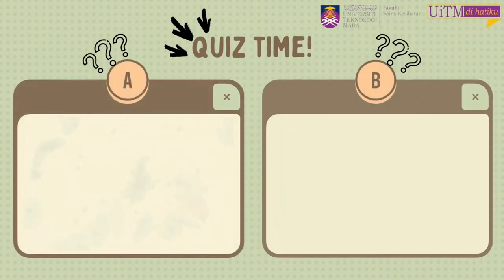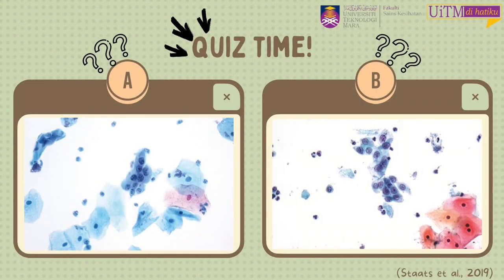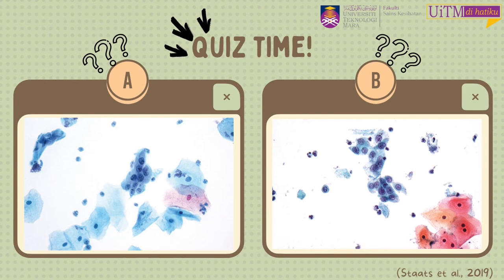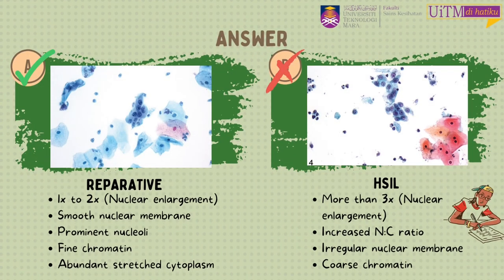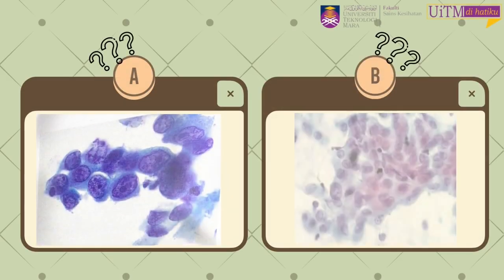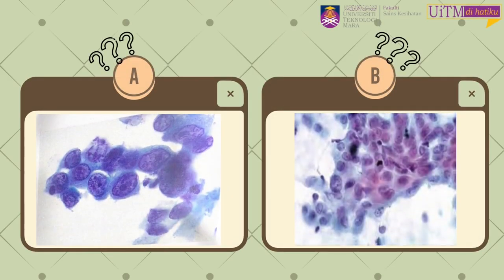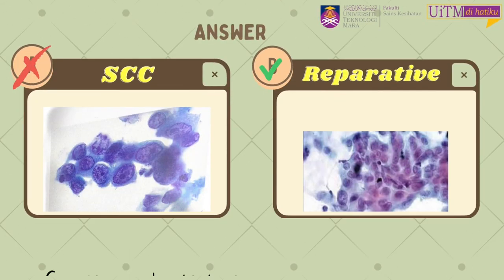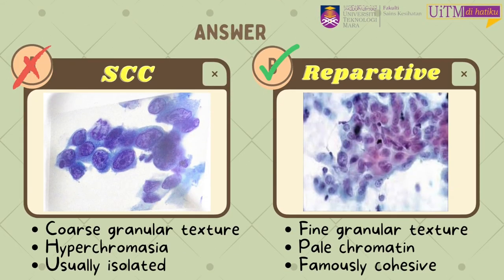Let's take a break by answering a quiz. Which one shows reparative changes — is it A or B? The answer is A, because the cells have one-to-two times nuclear enlargement, smooth nuclear membrane, prominent nucleoli, fine chromatin, and abundant stretched cytoplasm. For the next question, between the two pictures, which one shows reparative changes — A or B? The answer is B, because it has fine granular texture, pale chromatin, and cells are famously cohesive.